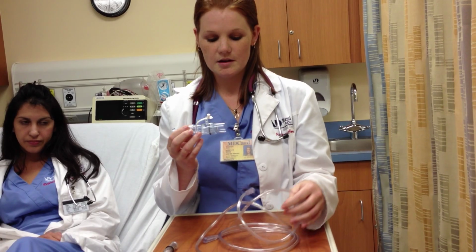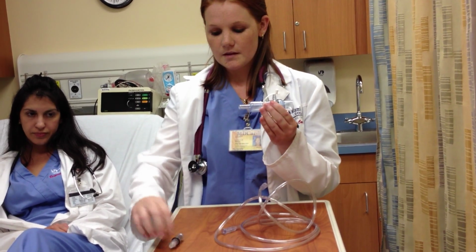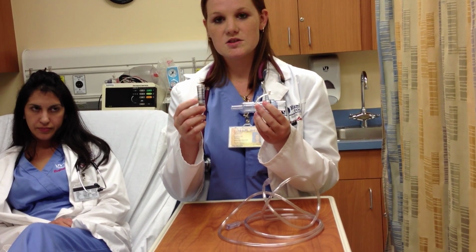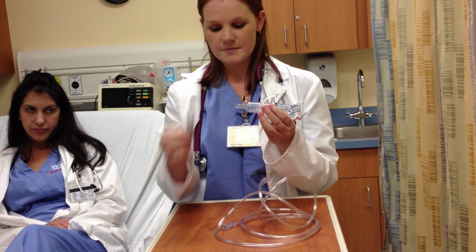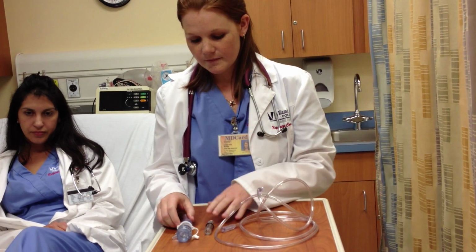You also need the tubing. This will connect the flow meter to the Easy PAP. This is your manometer. This measures the pressure by centimeters of water. Now that I've demonstrated the equipment, I would like to show you what you would do for this procedure.